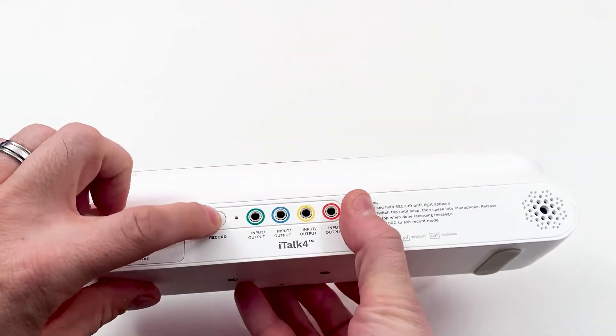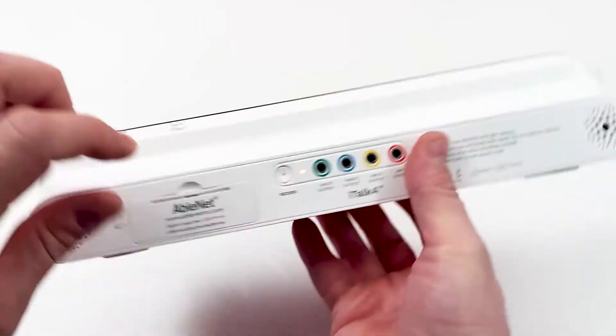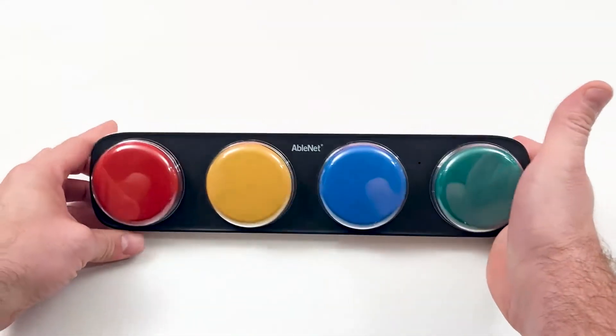With the level selected, I can now record my messages. I'll hold the record button until the recording indicator light lights up, then record the messages.